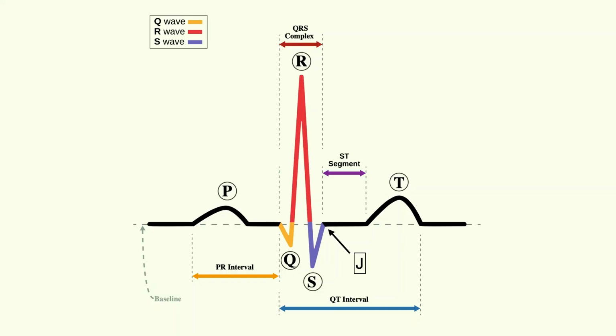And I'm guessing it's because everything got named, and they were like, oh, crap, we want to be able to refer to this thing later. And so that's what it ended up being named. But it is relevant. We talk about the J point from time to time. So just so we're all on the same page about the notation that we're using.